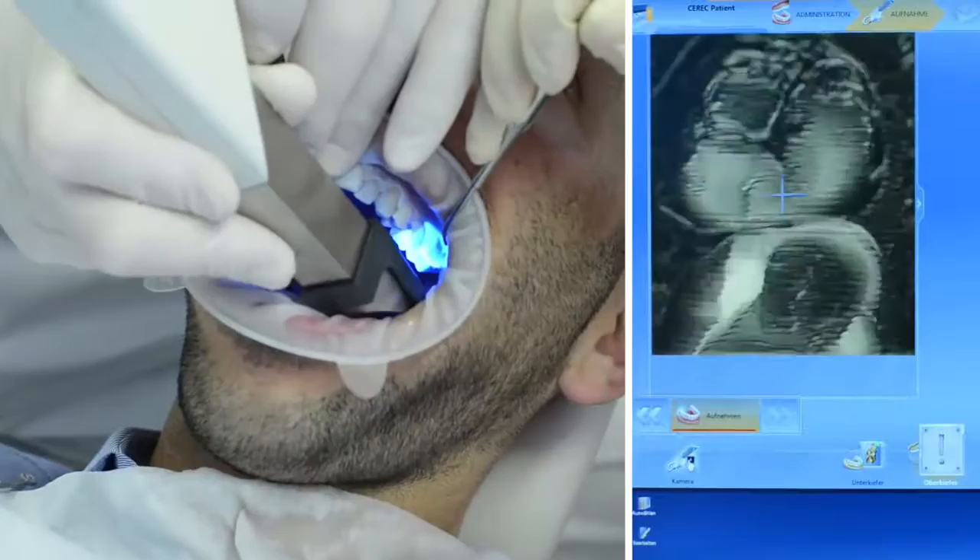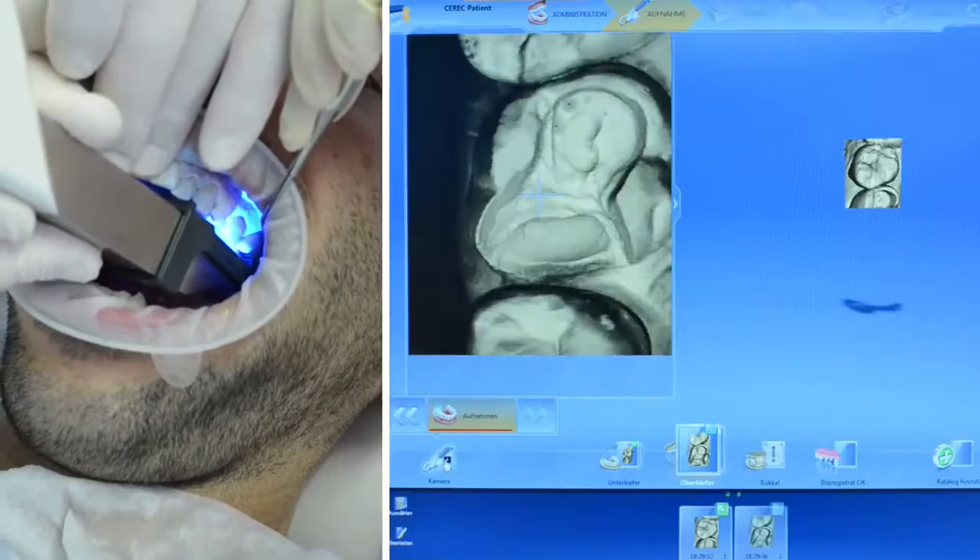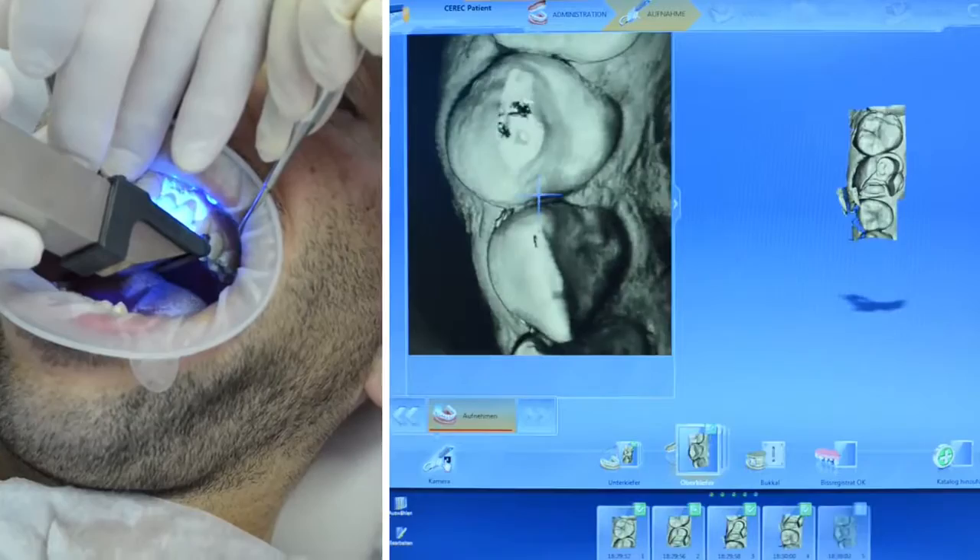With BlueCam, powdering and scanning follows the preparation. The camera can be rested directly on the tooth for each exposure to increase stability. The built-in shake detection system ensures images are acquired only when the camera is held absolutely still.